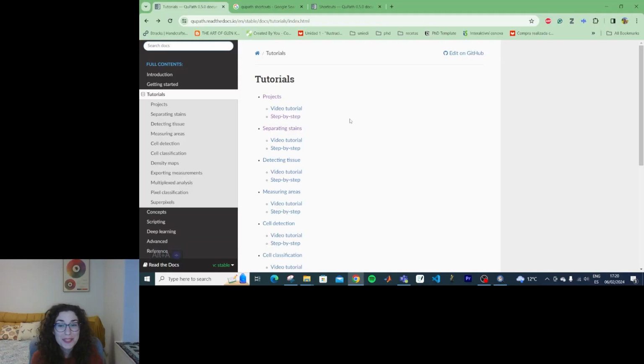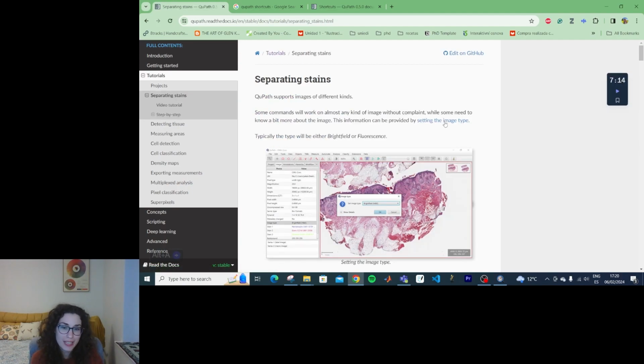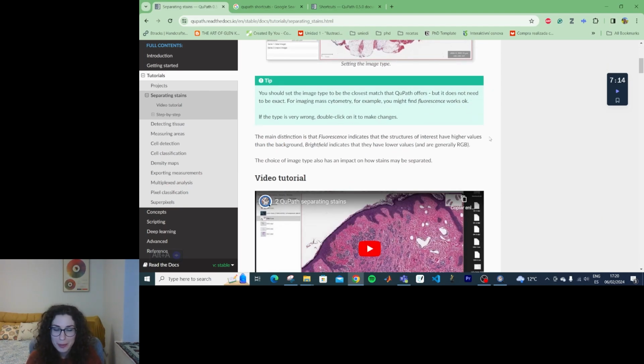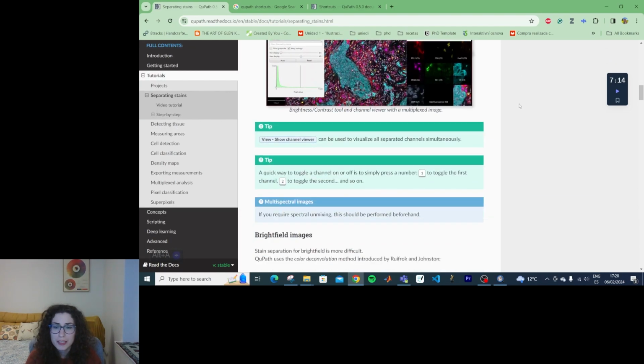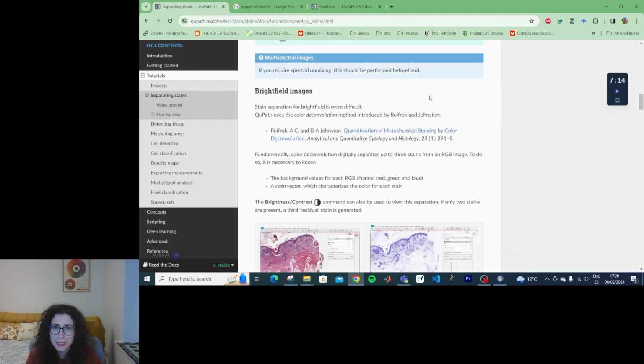Hi! In this video we're going to learn how to separate stains. I will be following the tutorial that is already part of the QuPath docs. We've got a very nice written tutorial, a video as well. It starts with fluorescent images.